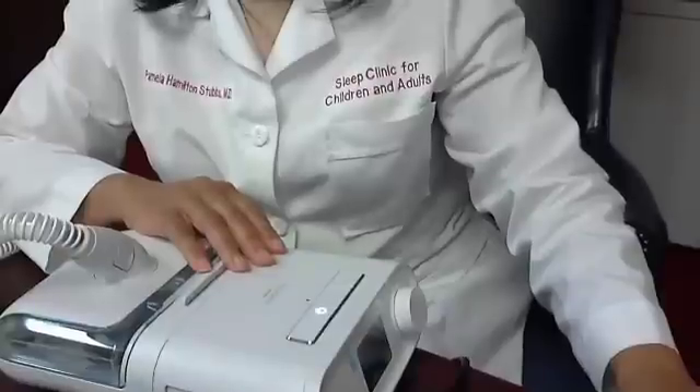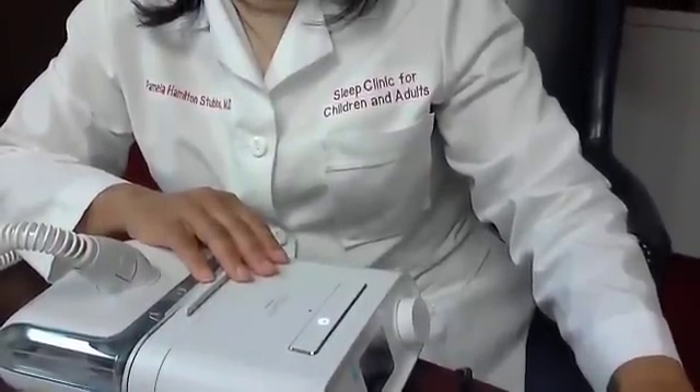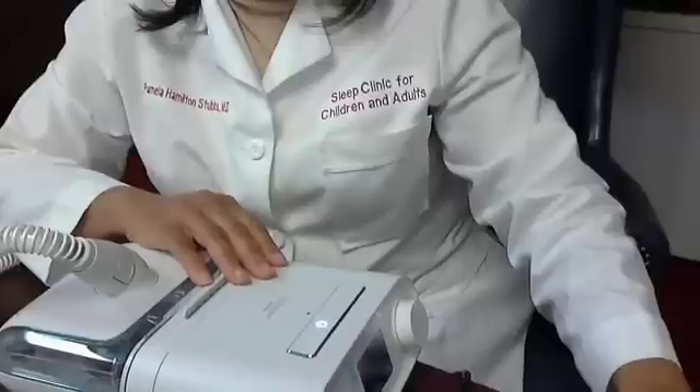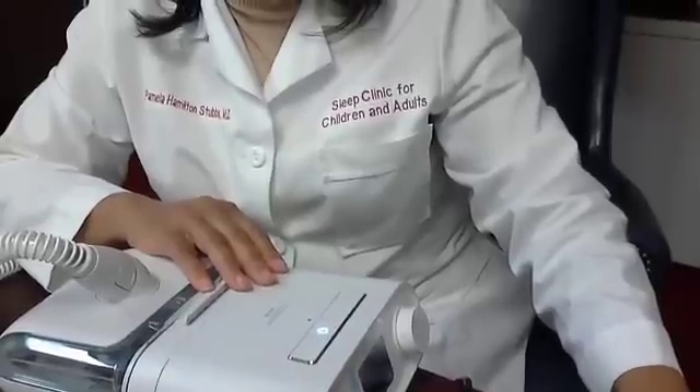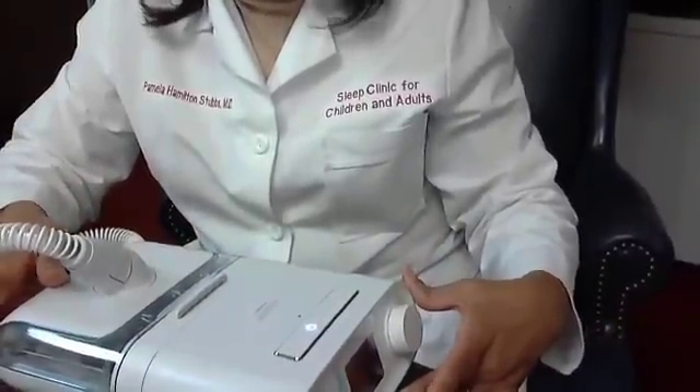If you forget your power cord, when you get home don't panic — just call the company and a new power cord can be ordered. It may not be covered by your insurance, but they're usually not that expensive anymore.